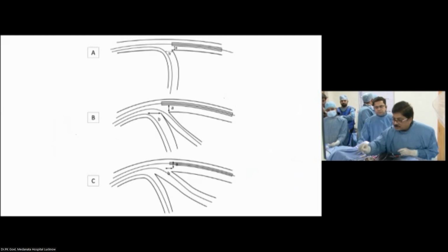This tells you A and B. A is the gap that the stent will expand. You imagine in your mind when it expands how much it will become. And from that edge, you should leave a distance from the circumflex wire, which is the true gap of the circumflex. And then you will be true in the ostium. Well, in this case, I can't do that, but I thought that I might do it.